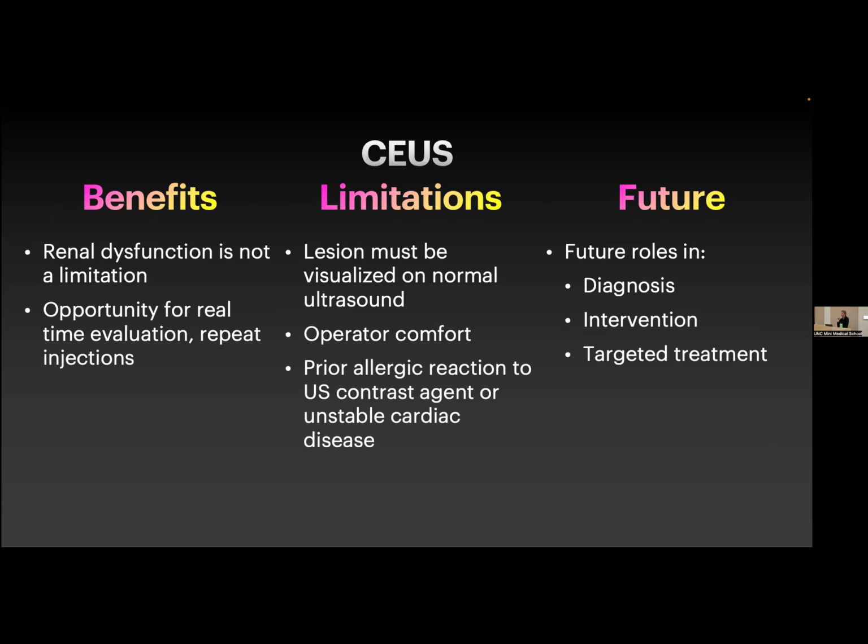The amount of contrast reactions to this agent versus CT iodinated contrast or gadolinium, the MRI contrast agent, is extremely, extremely small. And this has a really great potential role for things like diagnosing when we don't have the option of doing a CT or MRI. It has great opportunities for intervention.